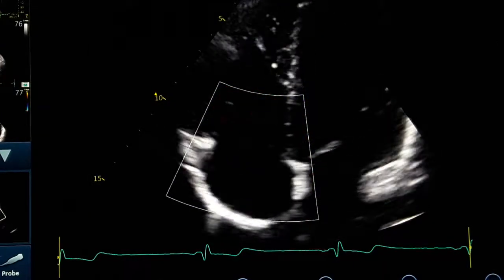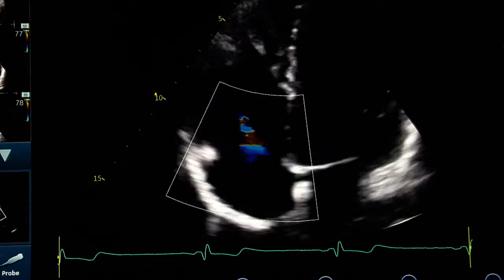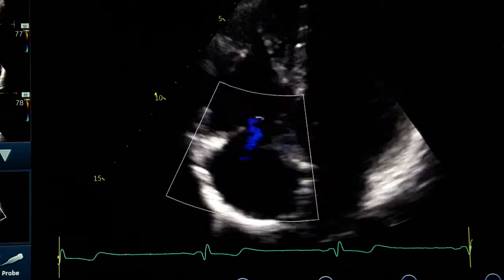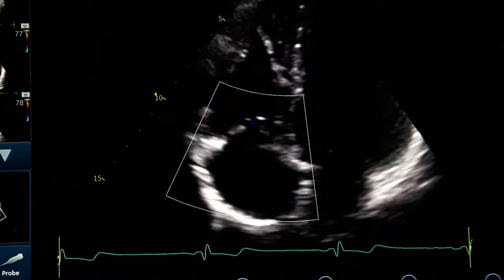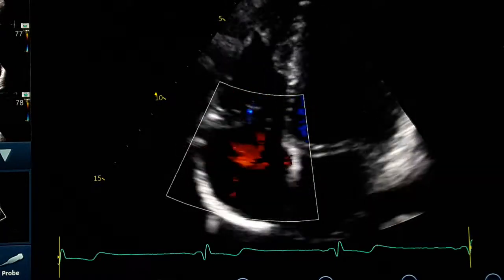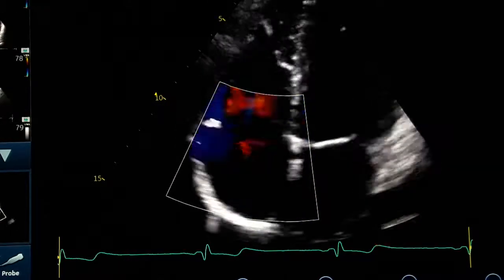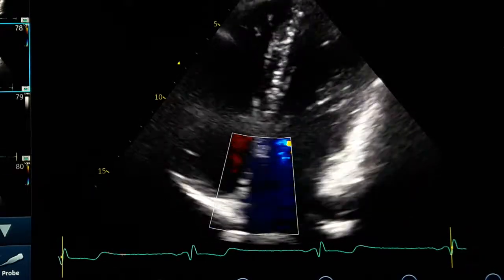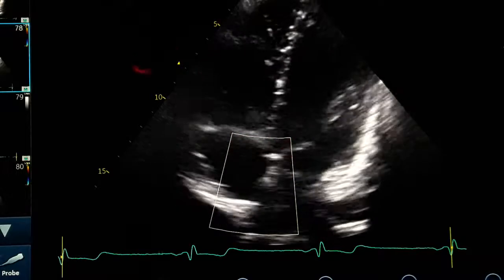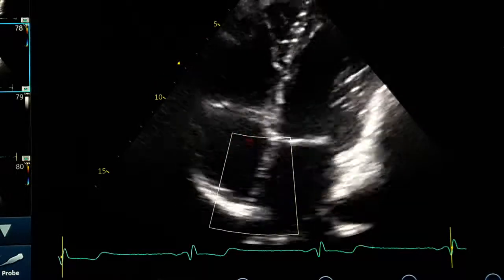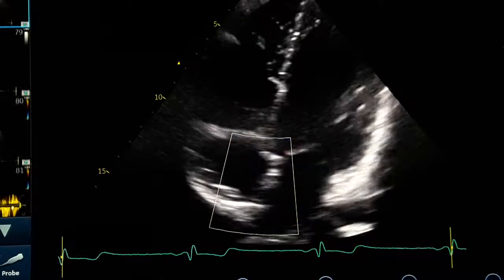With this approach, you can detect TR much better — often detecting it when you couldn't on the standard apical four-chamber view. As you can see here, a little off-axis, moving the probe to the midline and a little higher than usual, it helps for correct diagnosis of pulmonary pressure.